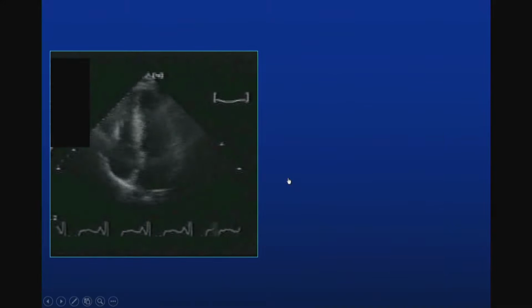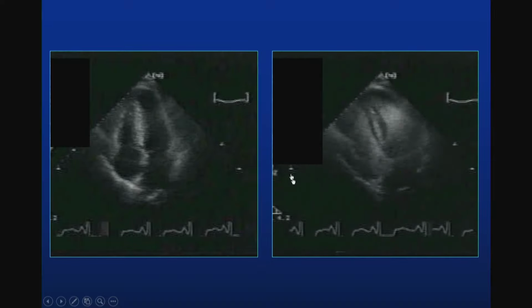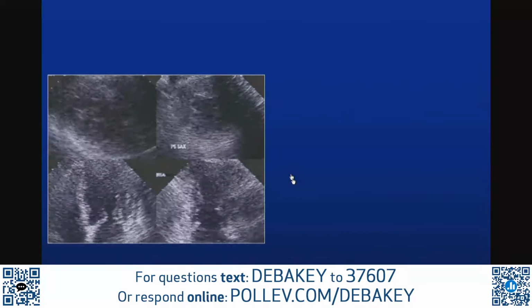Let's take another example here. All right, what can you tell about this heart? I can tell that it's most likely quite vigorous. That's the only thing I can tell. I cannot tell the thickness of this heart or anything else. Actually, this is a hypertrophic heart with hypertrophic cardiomyopathy. If you take a look, the septum is quite impressively thickened, maybe even with small trapping of the apical chamber, and certainly very hyperdynamic. So yes, I was right on ventricular function, but I was not correct on what the underlying pathology is.